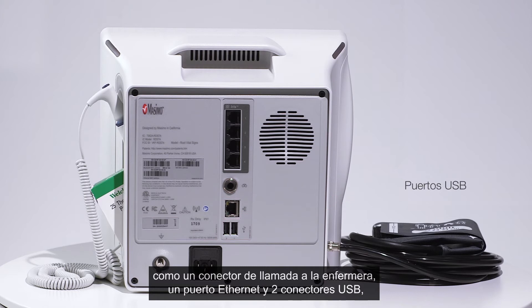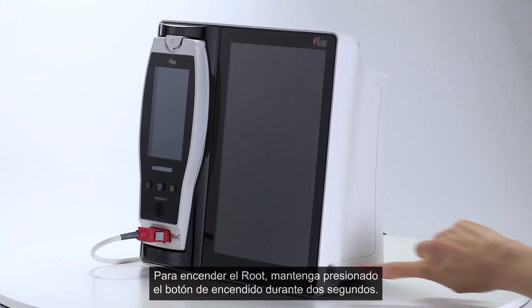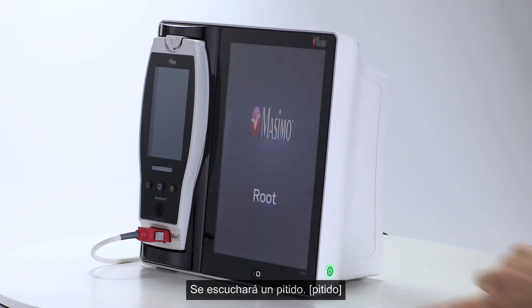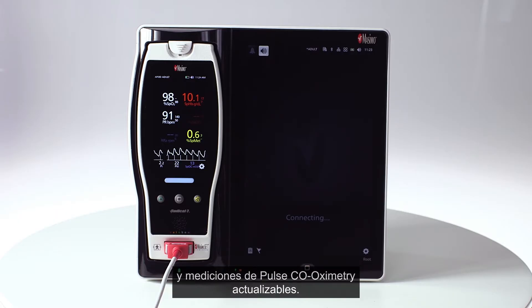A power entry module and an equipotential ground connector are also located on the back. To turn Root on, press and hold the power button for two seconds; an audible beep will sound. The Radical 7 snaps securely into place to enable immediate pulse oximetry and upgradeable pulse co-oximetry measurements.